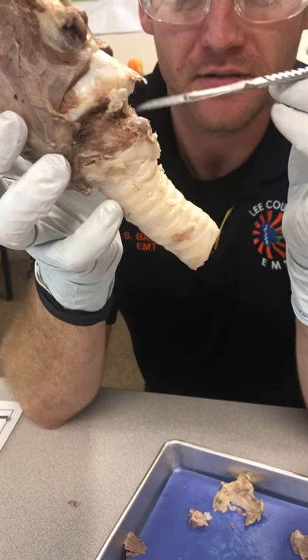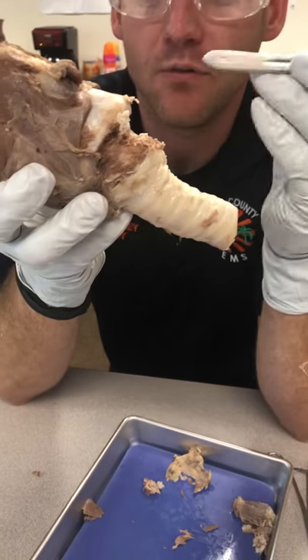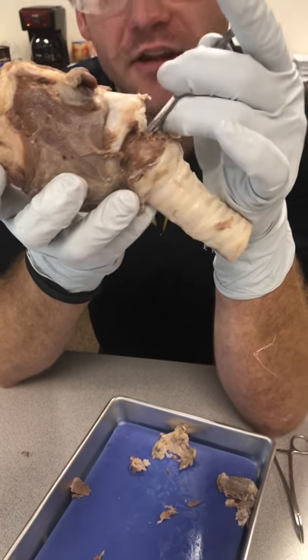This is much bigger than the original incision that we made. It was kind of difficult to feel when we would actually pass through the cartilage here — it was much deeper than we thought it would be, much more posterior. But once we felt it, we felt a good thud.